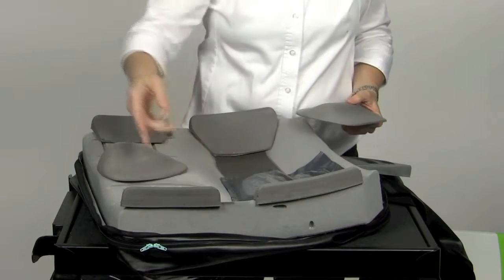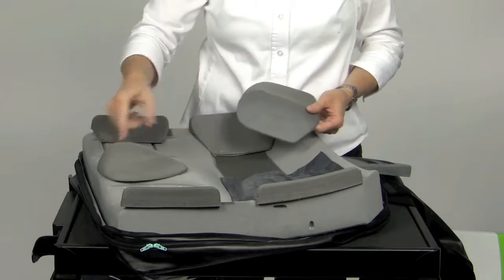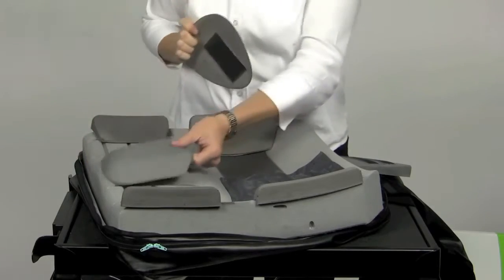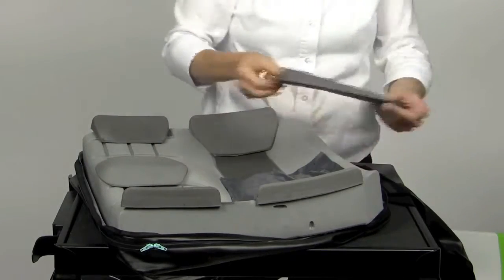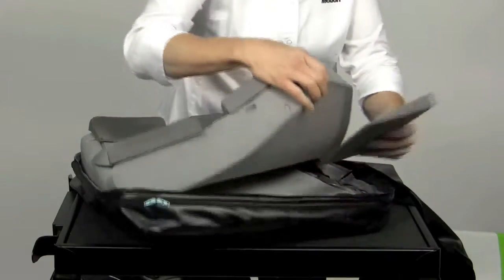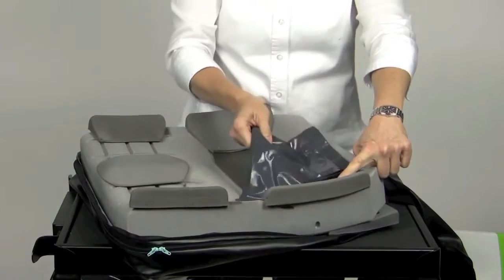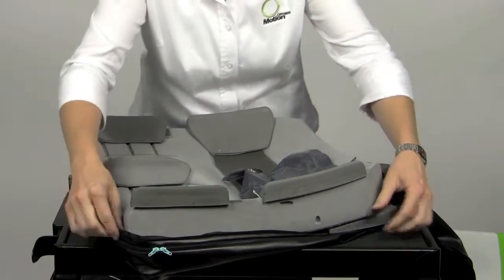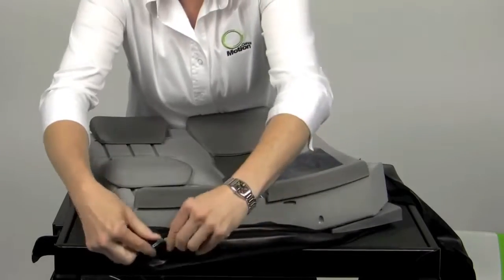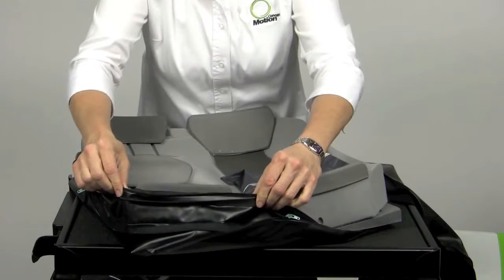FitKit positioning pieces provide lots of opportunity for accommodation of postural issues. Included are abductors, adductors, obliquity wedges, hip guides, and fluid supplement inserts that can be added to the cushion to meet the positioning needs of the patient. The suitcase style expansion cover allows the use of positioning pieces without the need to customize the cover.